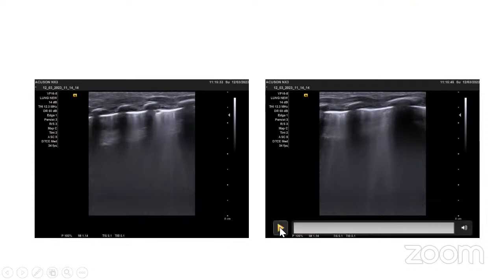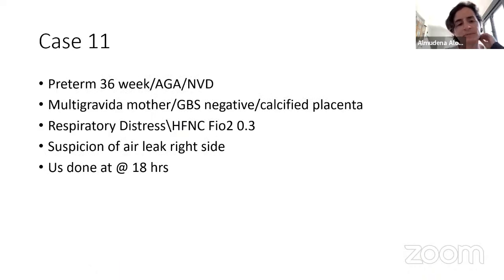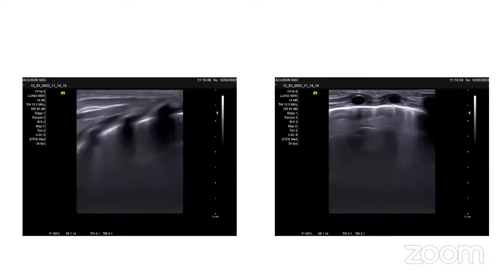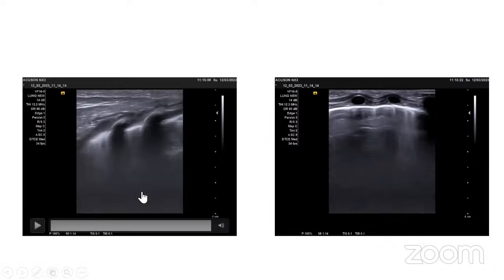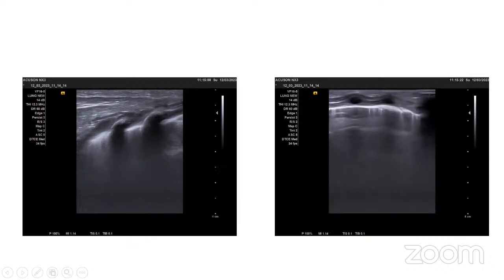Okay, fine. So here, this is L1, left lung, left upper. Here also there is some B line with A lines, so AB profile. Yes. Sorry, maybe I got confused here a little bit. Sorry, this is L2. This is L1, L2, sorry, I mistook it. But also the same issue, we comment on it.